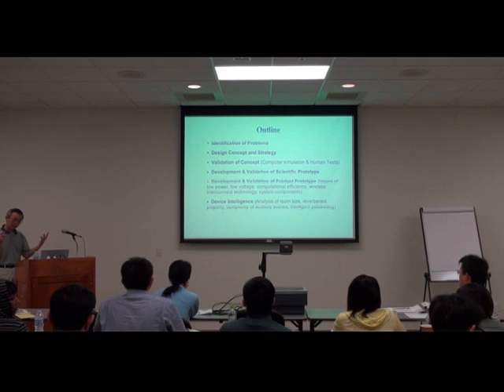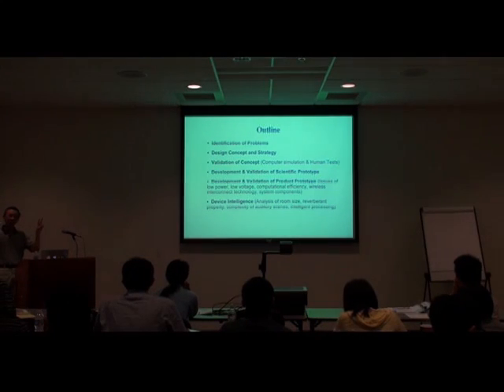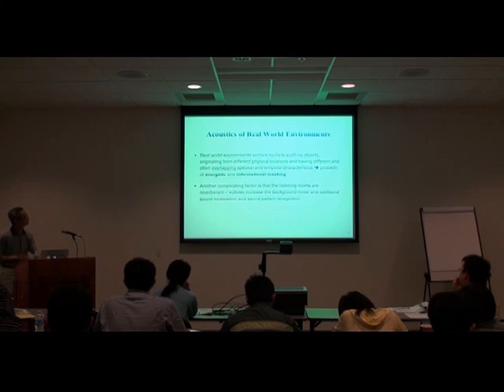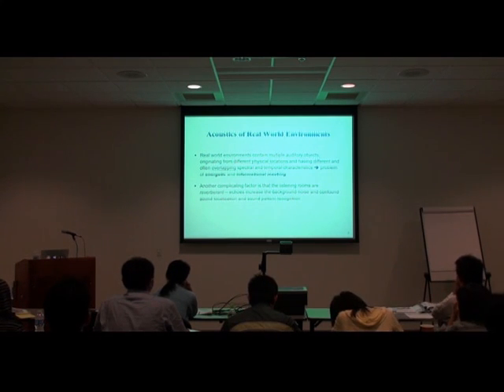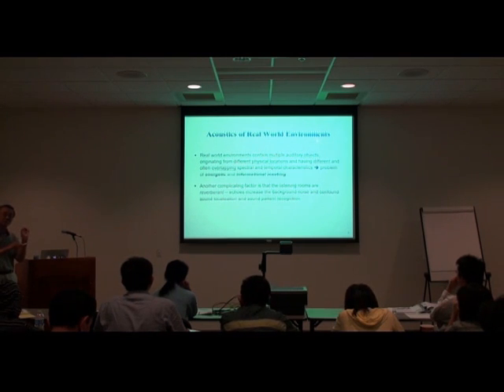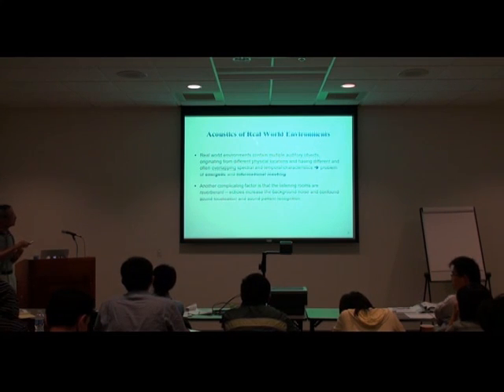So a lot of our thinking really comes from the biological root, in terms of how animals analyze sound, and how they deal with the everyday problem of sound communication. So first, quickly, let me talk about the real-world environment, because this is really crucial in terms of our design concept. We want to have a device that can operate in real-world conditions. And that is really the shortcoming of most hearing aids. They perform well in an isolated environment, but they don't perform well in a real-world environment.